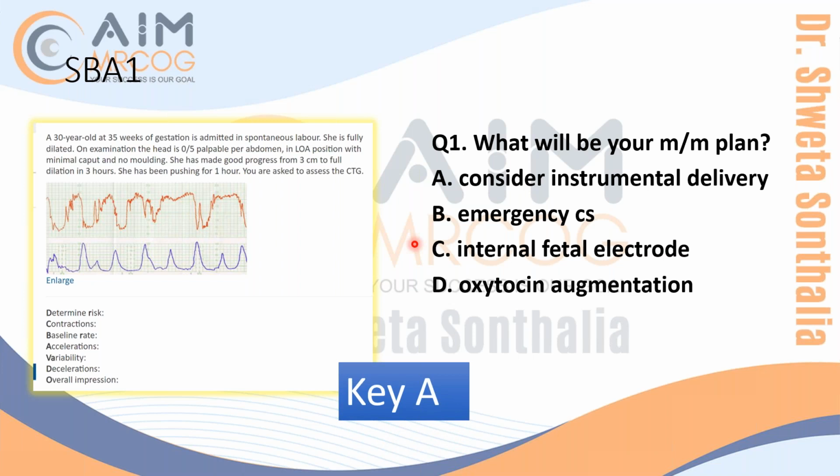This patient actually should be going for trial of forceps, isn't it? Because she is LOA with 0/5. Basically, they have not mentioned the station from down, how much it is, but yes, it could be trial, but it doesn't matter. Here, every question is made to test something. It's not like every time they are testing your knowledge of will you deliver in theater or will you deliver in delivery room. Whenever they make a question, they make a question with testing some part of your knowledge.